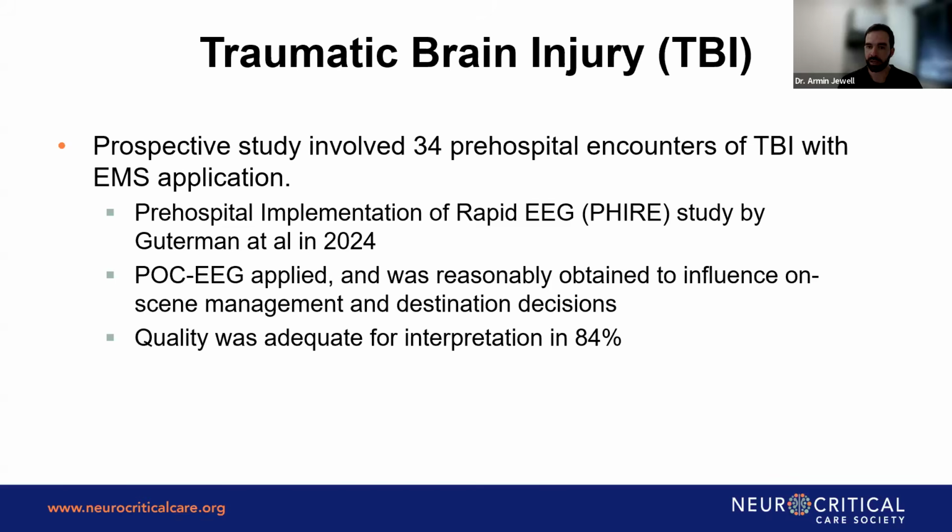One question, of course, that may come up is whether this technology is able to be placed by EMS. Is this something that can be trained and done? And 84% of the time it was an adequate quality study. So it seems like it was something that was able to be successfully placed. So this was an interesting early study for different uses of point of care EEG, even outside the hospital, to determine whether they need to come right to a high level trauma center or not.